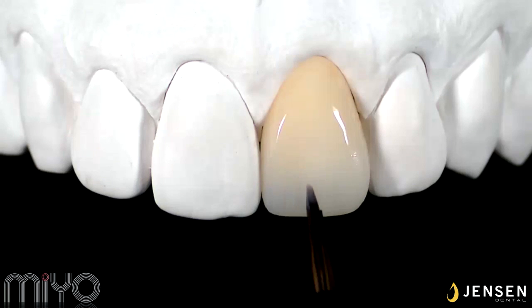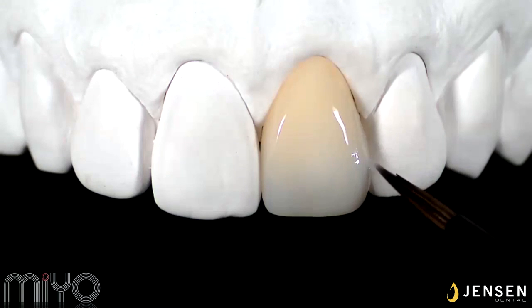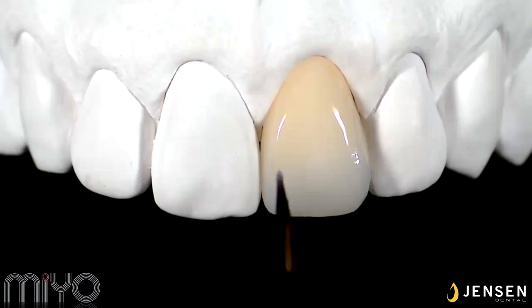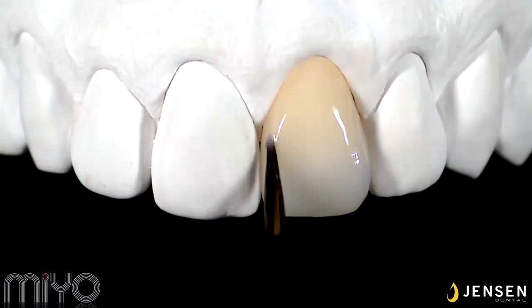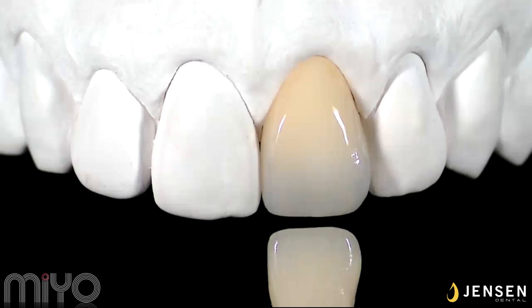Key to color application with MiYO is to really avoid having any kind of brush strokes on the surface. Always dab and drag the colorants. You could also create some subtle low value spots or bands according to what you see as your final target using translucent storm. Check the shade tabs again for target value before all the effects are applied.